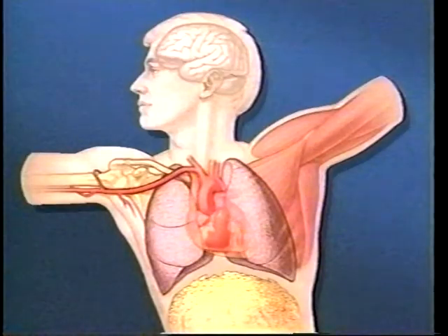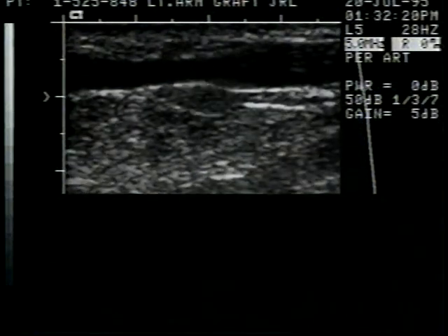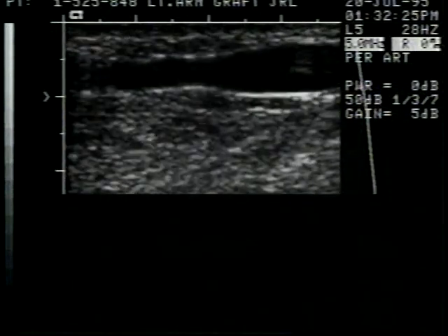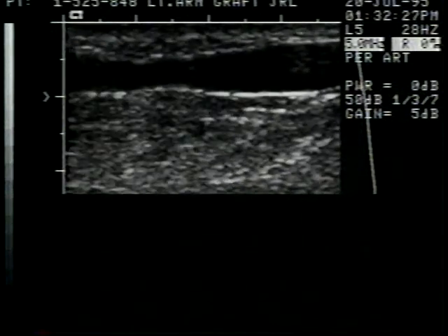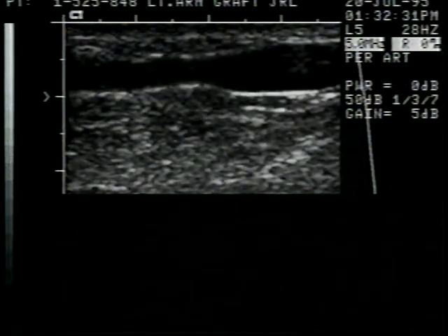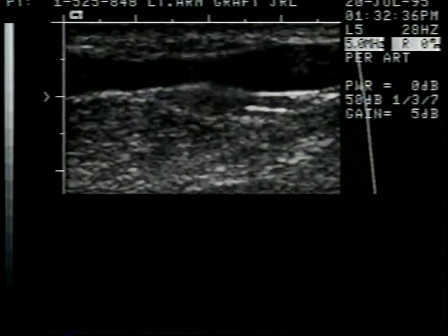Within our bodies, muscles and soft tissue exert an external force against the blood vessels. Blood pressure supplies the opposing force, so these vessels will not collapse. During systole, the velocity in a stenosis can increase enough to lower the intravascular pressure to less than the atmospheric pressure, and the vessel closes. During diastole, the process reverses, and the vessel reopens, as seen in this example of a stenotic hemodialysis graft.